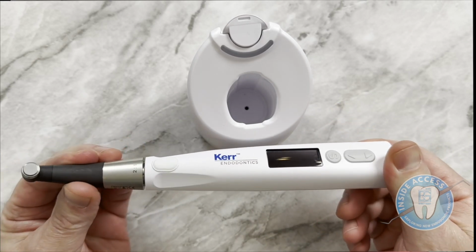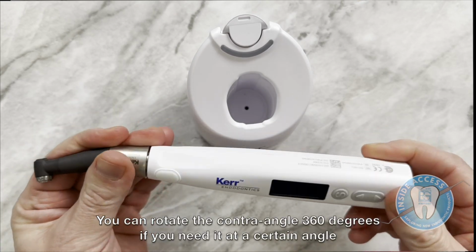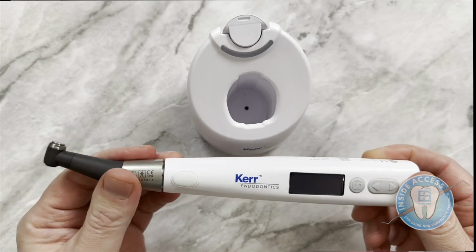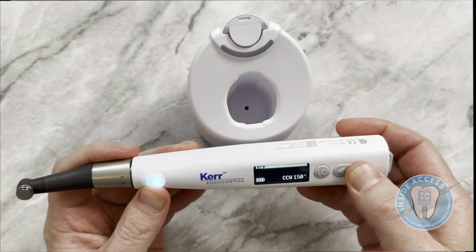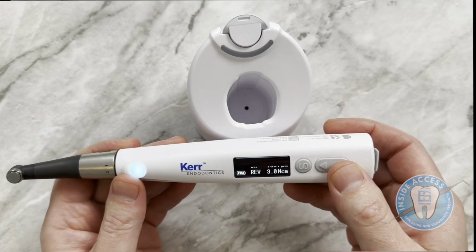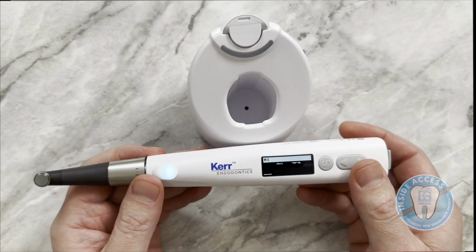You do have the contra angle. It is a 2-to-1 contra angle head. One cool feature about it is you can turn it. So if you have a certain angle that you need, you can turn this 360 degrees, which I think is pretty cool. So I'm going to start by firing it up by hitting the little rheostat button. Now it is important to know that you can adjust this display for a right or left hander. And you can see it's blinking there. That's just from the camera angle here and the camera from the GoPro.